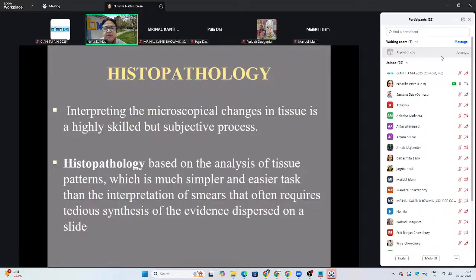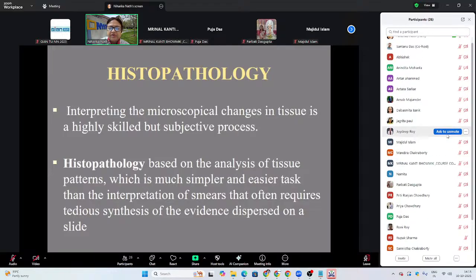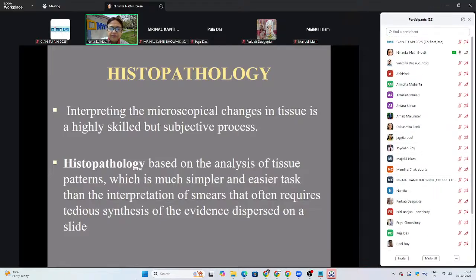And for that reason, histopathology always has to be done independently by different histopathologists for the same slide. Those are protocols that are set so that there is no subjectivity, and if there's any bias, then that is caught. So we look for tissue patterns. We already know what tissues look like. So we look for these various patterns that might be slightly different from what is normal.